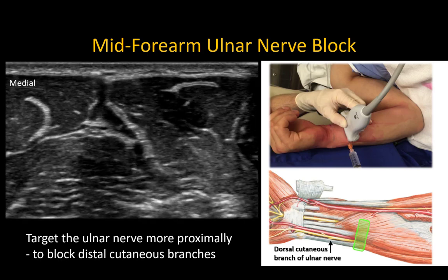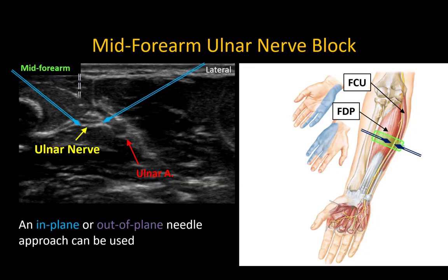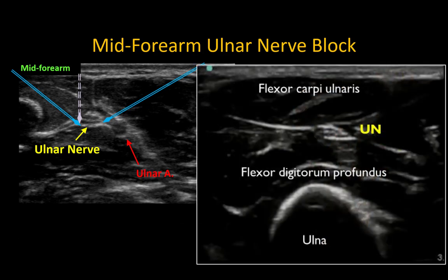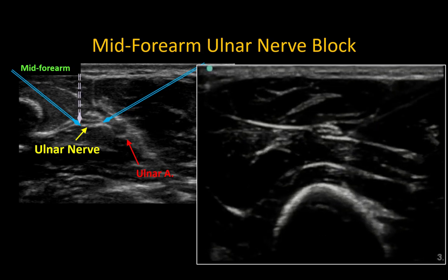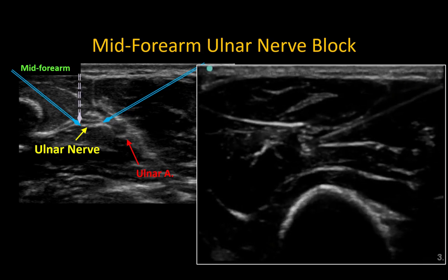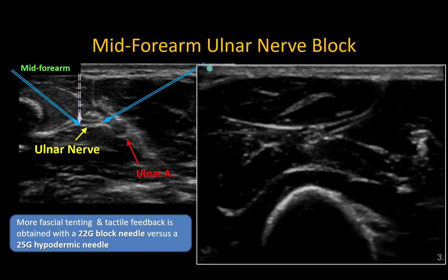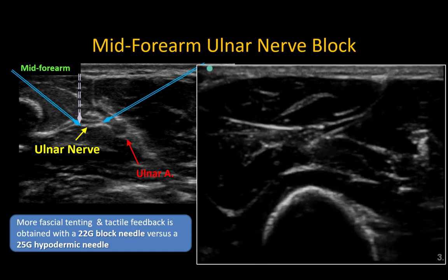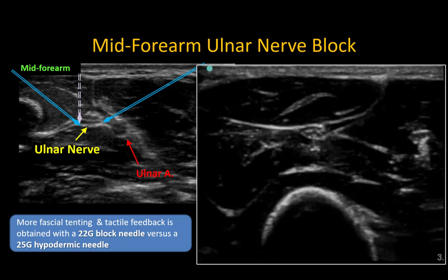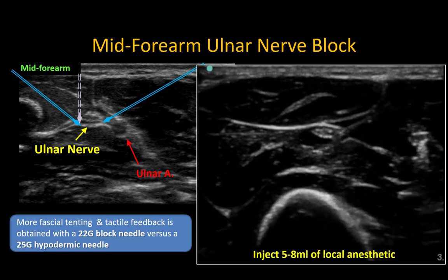Target the ulnar nerve more proximally to ensure that the distal cutaneous branches are blocked. An in-plane or out-of-plane approach can be used depending on what is ergonomically most feasible. Always advance the needle tip at a tangent to the nerve to prevent mechanical trauma, aiming to pierce and inject into the fascial sheath to surround the nerve. A short-bevel 22 gauge block needle produces more fascial tenting before it is pierced compared to a sharp 25 gauge needle. Five to eight milliliters of local anesthetic within the sheath will block the ulnar nerve effectively.